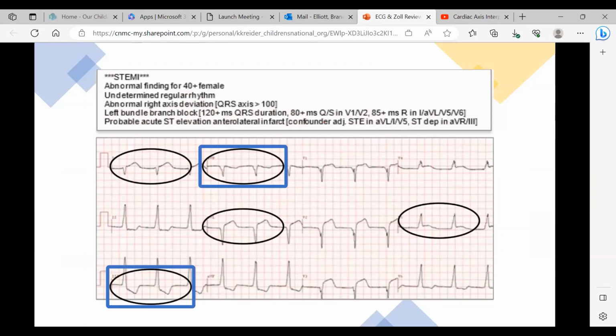It's probably left bundle branch. Yeah, left bundle branch. I have another picture later on that you'll probably see. That's why I talked about the turn signal rule. If you push your turn signal down, you're turning to the left. If you push your turn signal up, you're turning to the right. Down is left, up is right, and V1 is able to take the picture where it splits in the heart, and that's the best example of where it would be at.